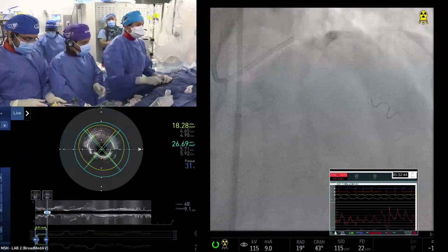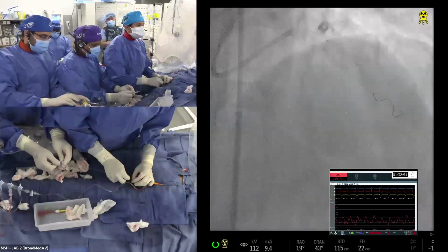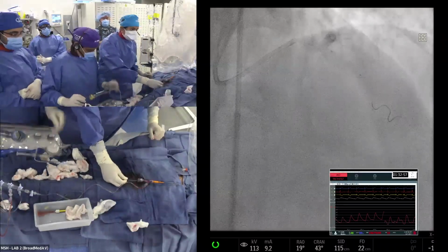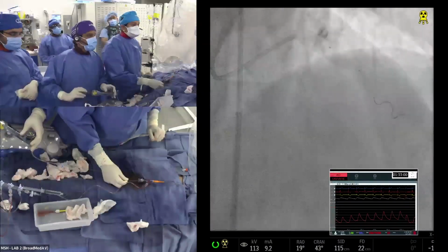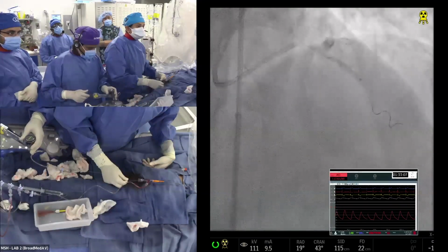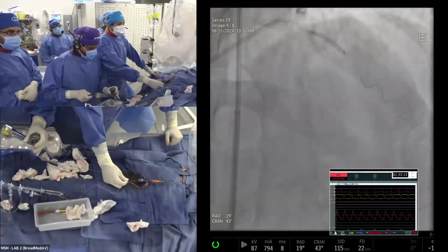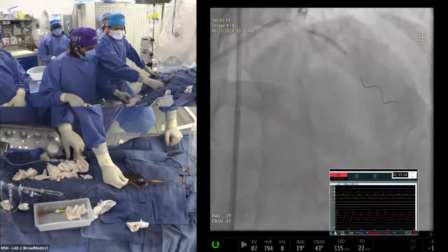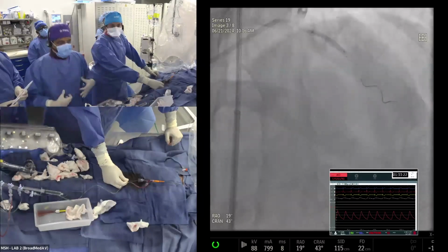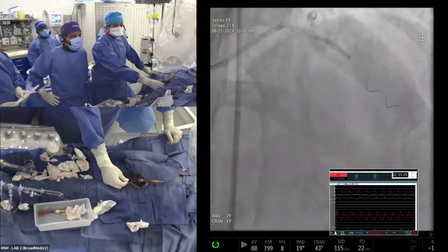Dr. Sharma, why did you prefer a hydrophilic wire for the side branch? Well, we always have, and I know the data, the electron microscopy of the side branch wire. First, with a hydrophilic wire, it's easier to cross. If you're asking about jailing, a lot of people believe the coating comes off, but I know from electron microscopy that does not happen. Second, we have always seen it is much easier and does not get stuck in the jailed branch.